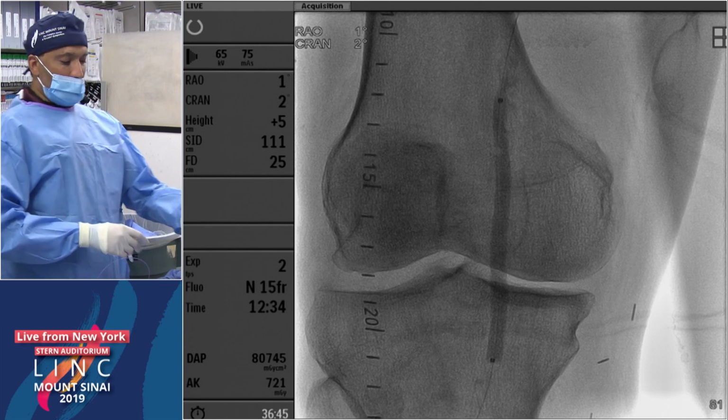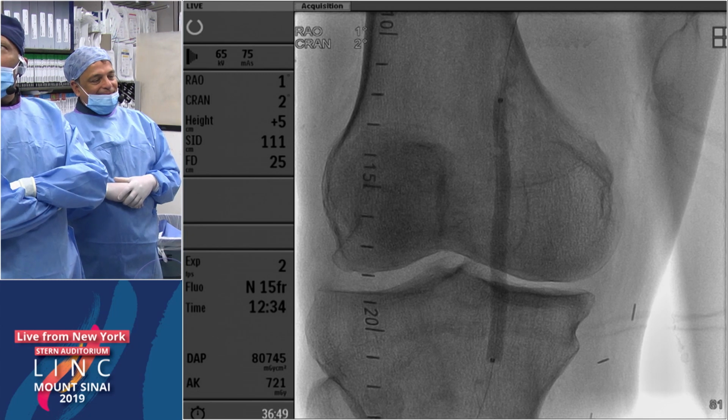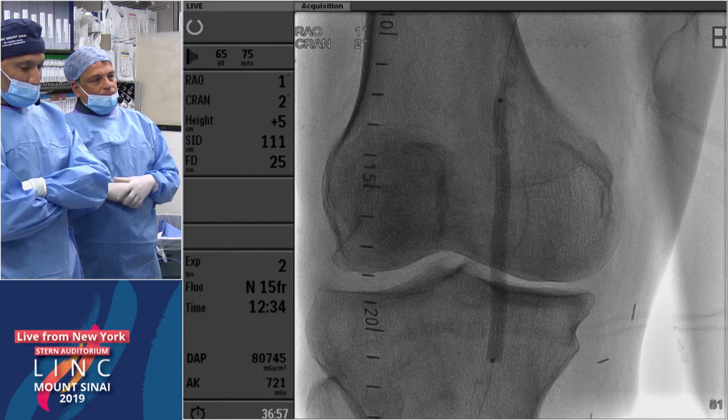That said, this one looks like a fairly sizable one, so you may find yourself using a covered stent. So I guess the next step here, you've got nice control of it. I'd probably say I'd get a balloon that's appropriately sized on a smaller platform, 014 or 018, to get down to where that perf is, maybe a little more distally, treat that vessel with that balloon, and get ready to put a covered stent in there.